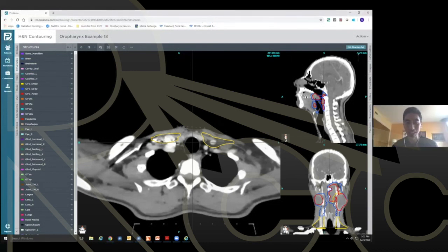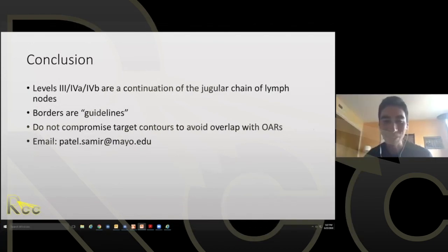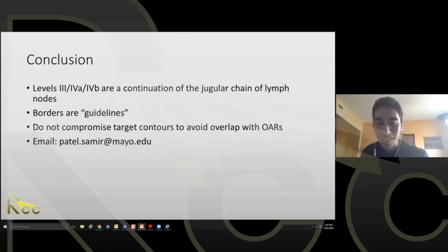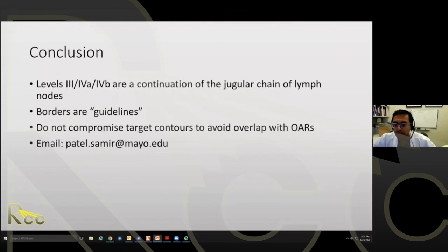Excellent. Dr. Patel, I'm going to say my official thank you after there's one more question. Sure. So one resident wanted to clarify, do we include the whole SCM on post-neck dissection cases? Yes, that's a good question. So I always include at minimum the medial half of the SCM. But to be safe, if you're unsure, just include the entire SCM.